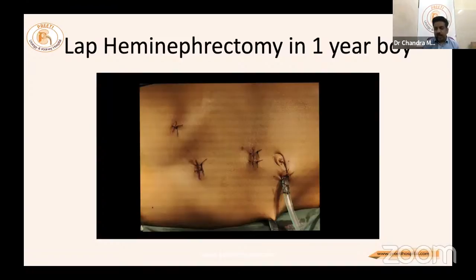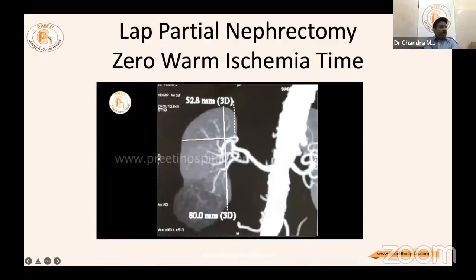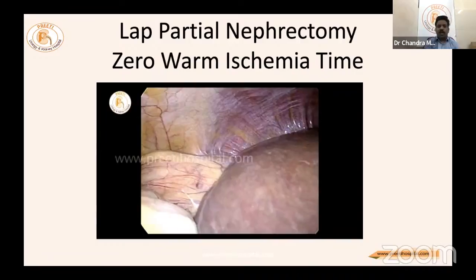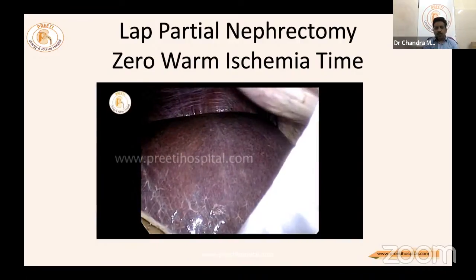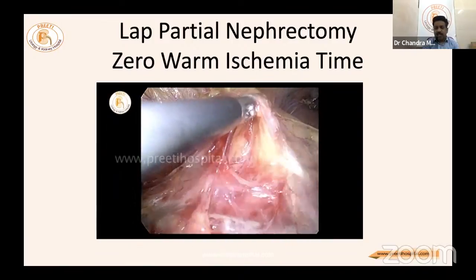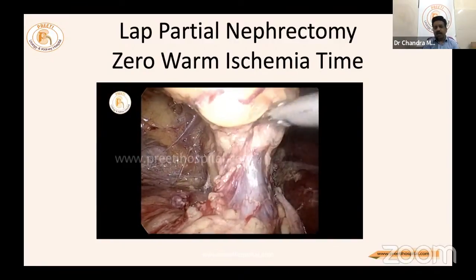Case 3: An 84-year-old lady with hematuria, diabetes, raised creatinine, and a lower pole mass of 4 centimeters. This is a three-minute video. Renal arteriogram is essential — even if CT scan is available, repeat the arteriogram. Port positioning and separation are the same. Hilar dissection is very important — in hilar dissection, identify the main renal artery.